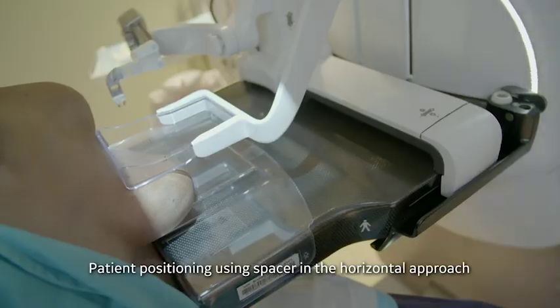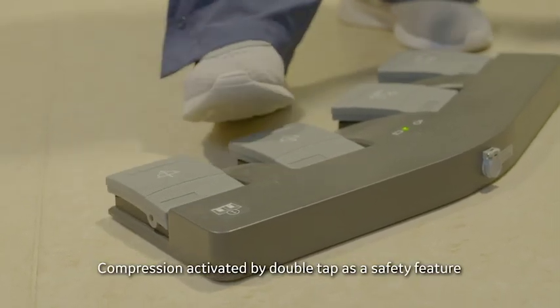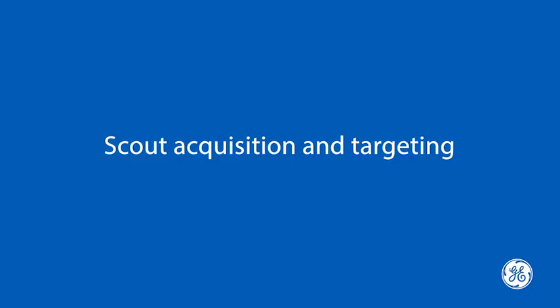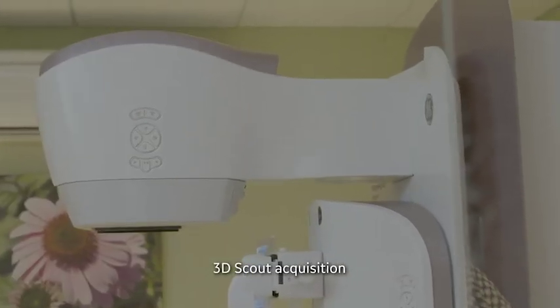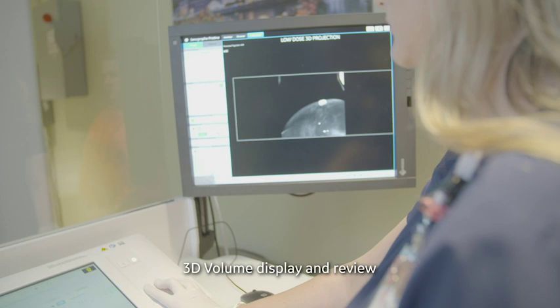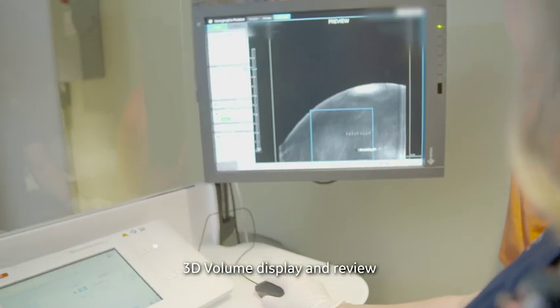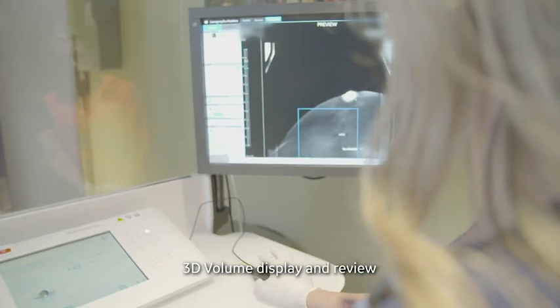Compression is lowered to hold the patient during the exam. The technologist uses the foot switch. A double tap is a safety feature during compression. For this exam, we are taking a 3D acquisition for our scout view. Images are displayed immediately, and the technologist scrolls through the breast to find the area of concern.